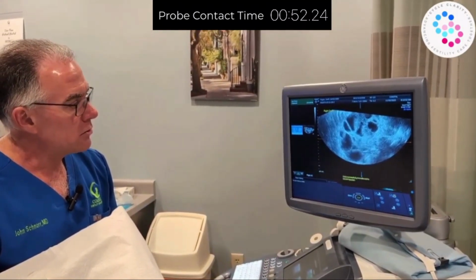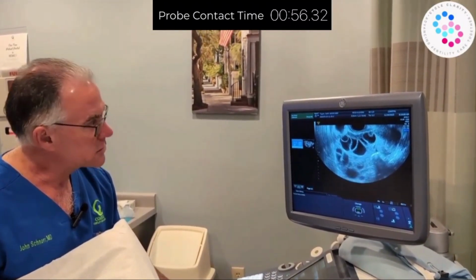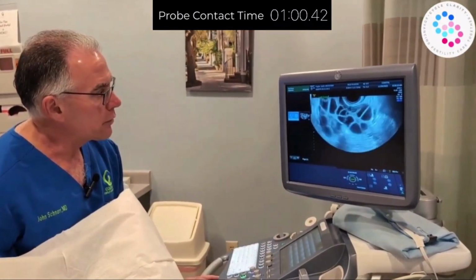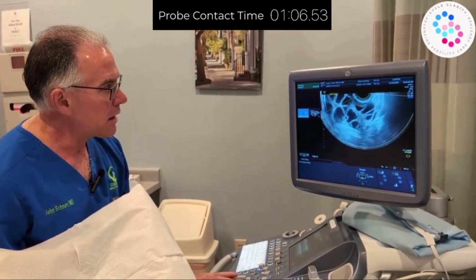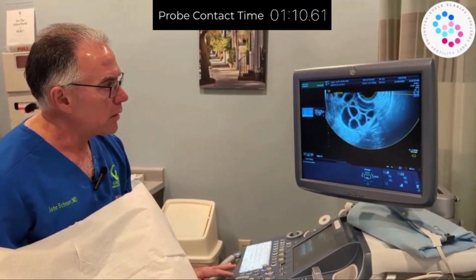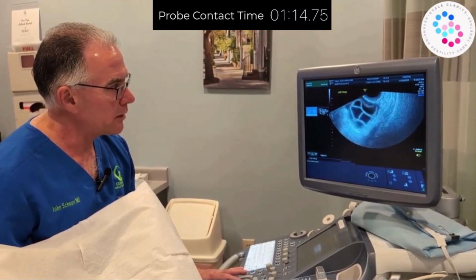Second thing we're going to do is now take a look at your left ovary. Your right ovary ultrasound went just great. We're going to label it left ovary and move over to it. Now these are kind of kissing ovaries, so I'm going to set this window up in a way that cuts out this left side of the ovary, which is right now going to be red otherwise. And we're going to go ahead and scan this. Here's your left ovary being red.